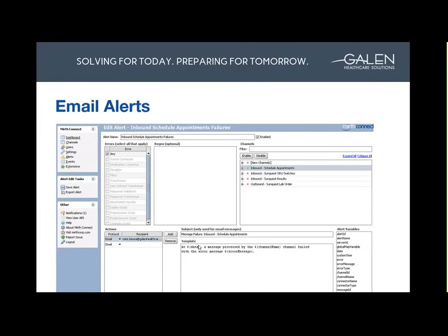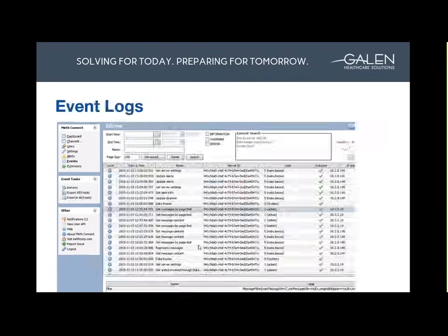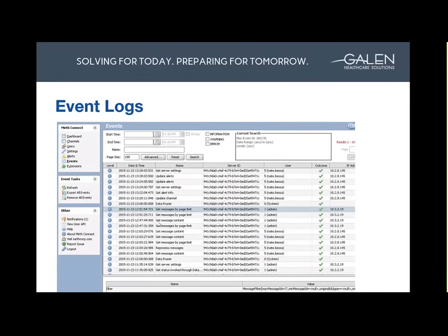One more useful screen in terms of logging and alerting is the event log screen. This is more specifically for system-level changes and problems. If MIRTH restarted overnight and no one is sure why or when, perhaps due to a network outage, you can see at what time MIRTH was shut down. If someone has modified a channel, you can see what user modified it and the IP address they were connected from. If a data pruner job ran overnight, this is one way to know that job is running.